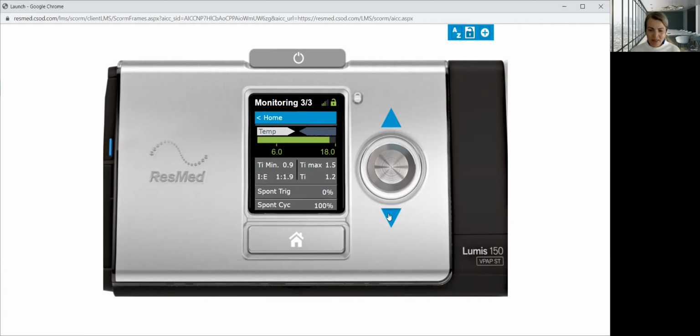But in real life, I suggest you follow the treatment for 10 or 15 minutes after any changes, to make sure that the setting changes you have made are enough for a better outcome, and only then decide whether any further settings need to be changed or not.